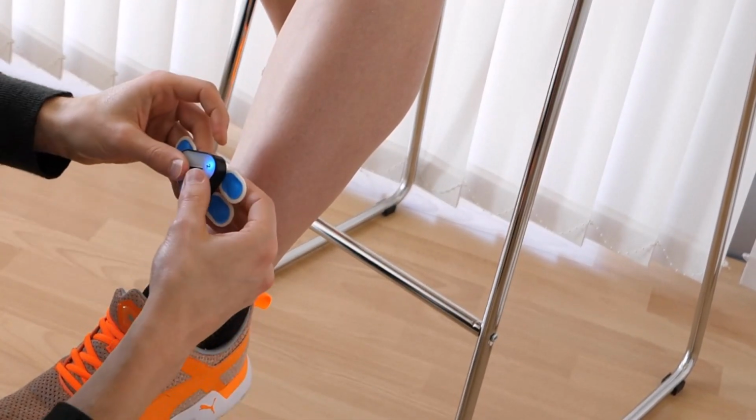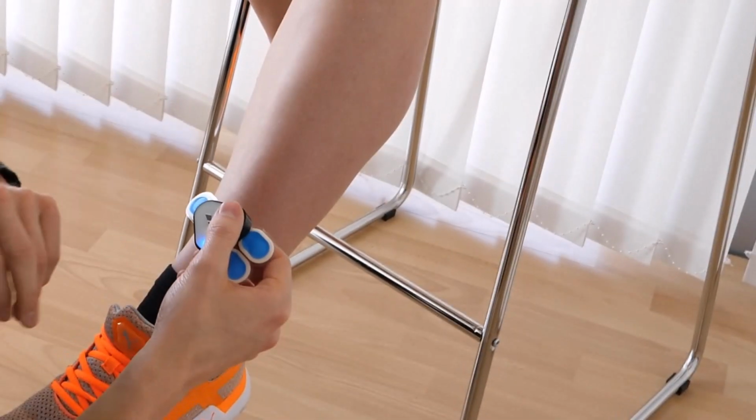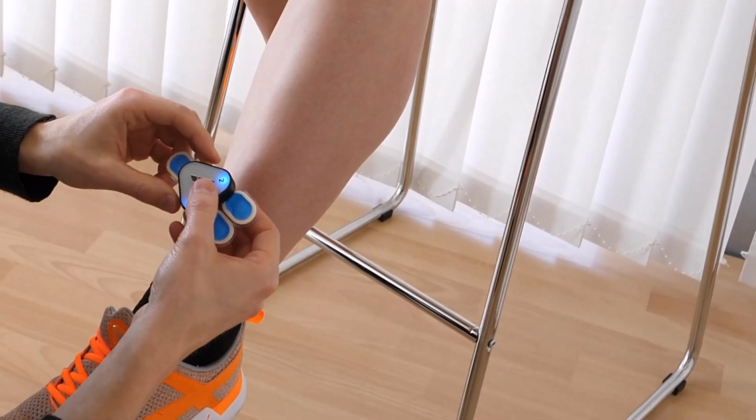For the vast majority of on and off measurements, it is sufficient if we use the arrangement of electrodes used here. If we want to be specific about the amplitude, it is a good idea to use the extension leads.